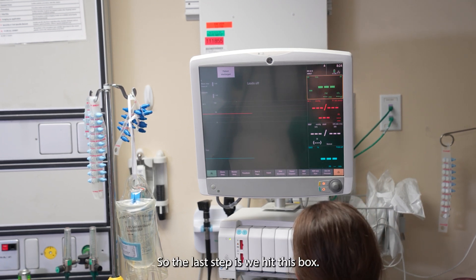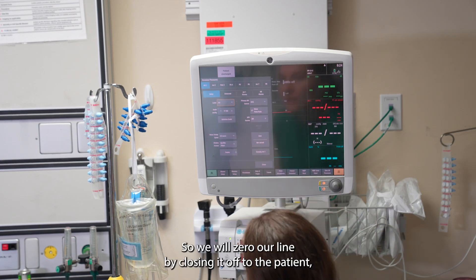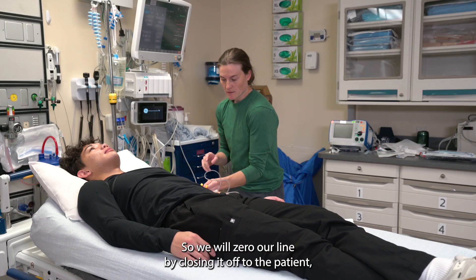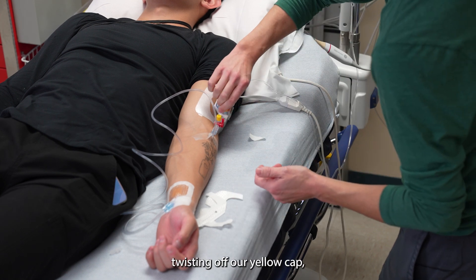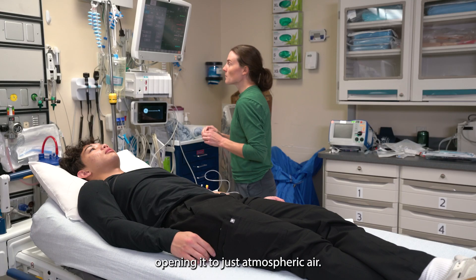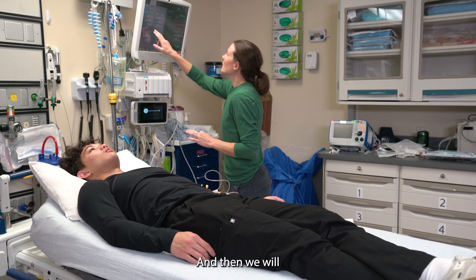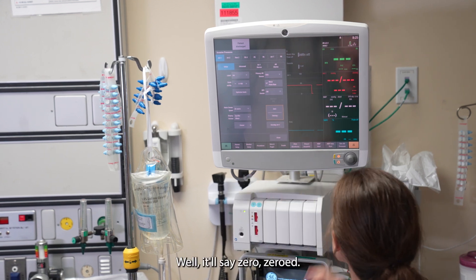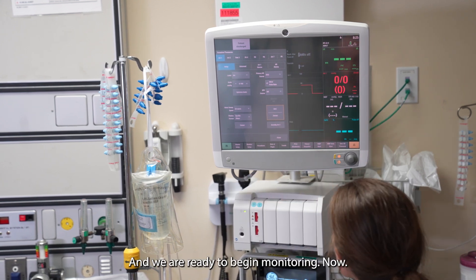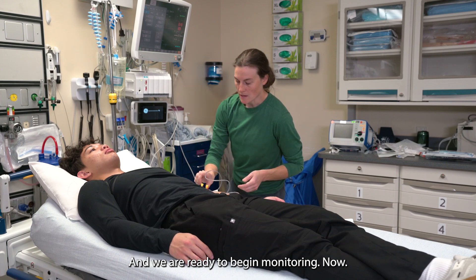The last step is we zero our art line by closing it off to the patient, twisting off our yellow cap, opening it to just atmospheric air, and then we will zero. It will say zero, zeroed. We are ready to begin monitoring now.